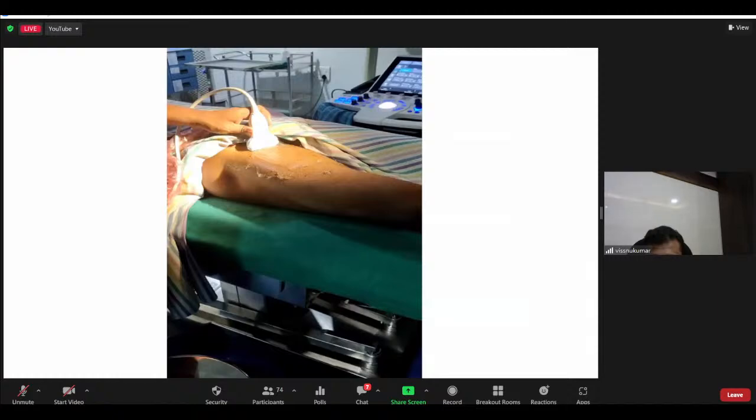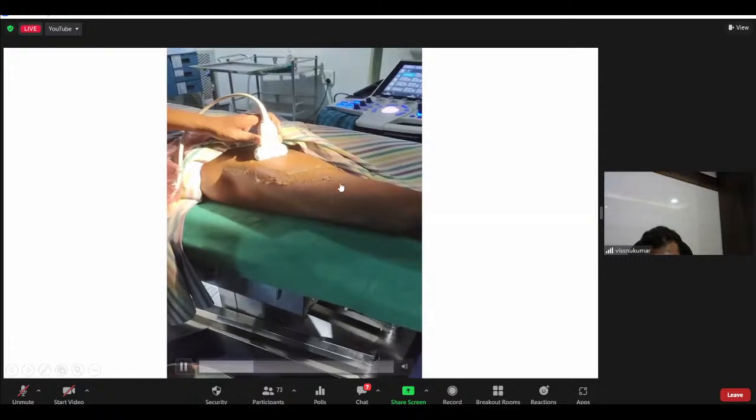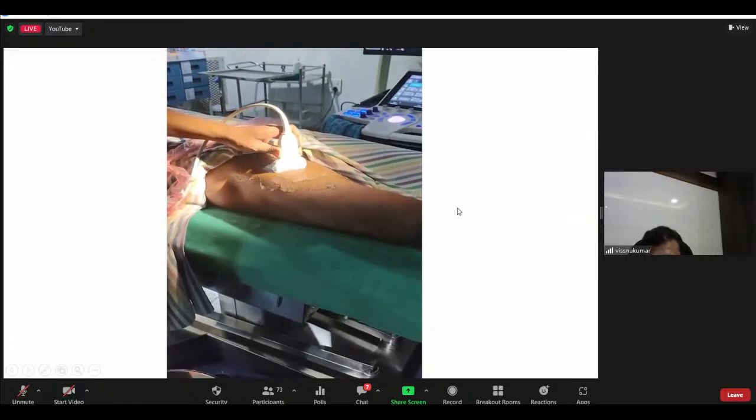Now here I am just showing you. See, first my image is always in the same position. Femoral nerve you'll be doing here. Femoral nerve block. Once you palpate the femoral artery, you just place the probe linearly. Now you are just going to scan the probe distally. Let me show in this diagram. You are scanning the probe distally from cranial to caudal.